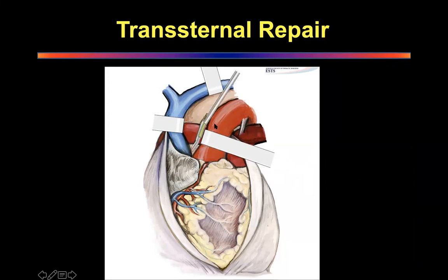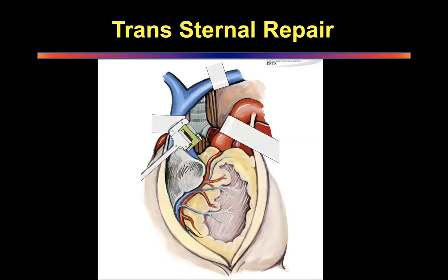When you open that, you actually see the bronchial stump, and you re-staple it proximally, much proximally, so that you get a healthy tissue. See here, they've re-stapled it much proximally. And Dr. Ball has done a few of these cases, and I listened to his presentation, and they have got really good results with this technique.